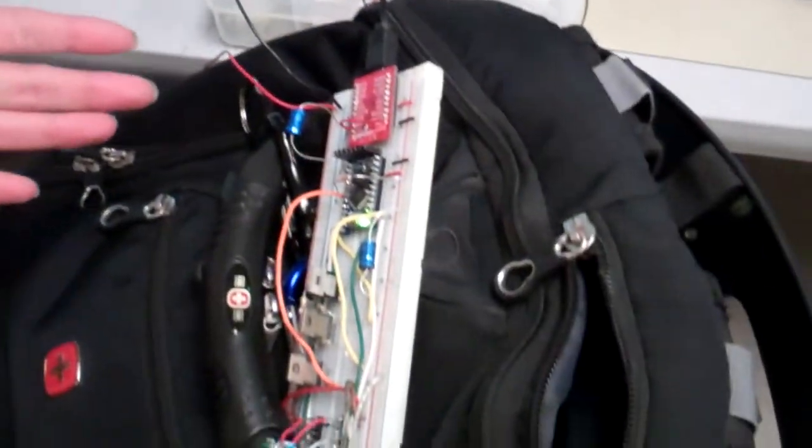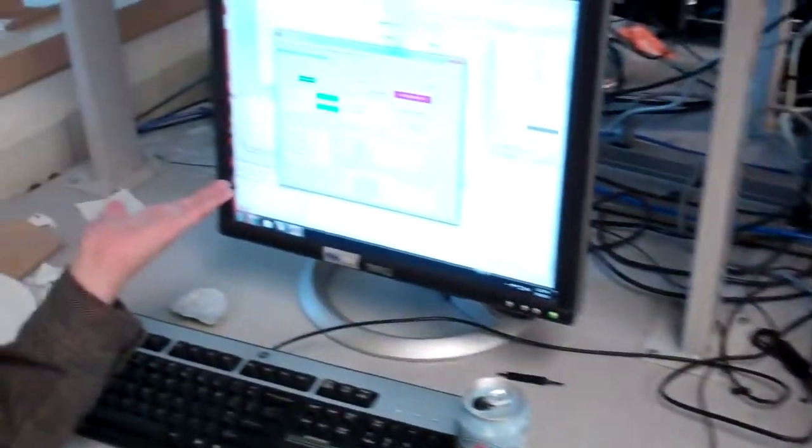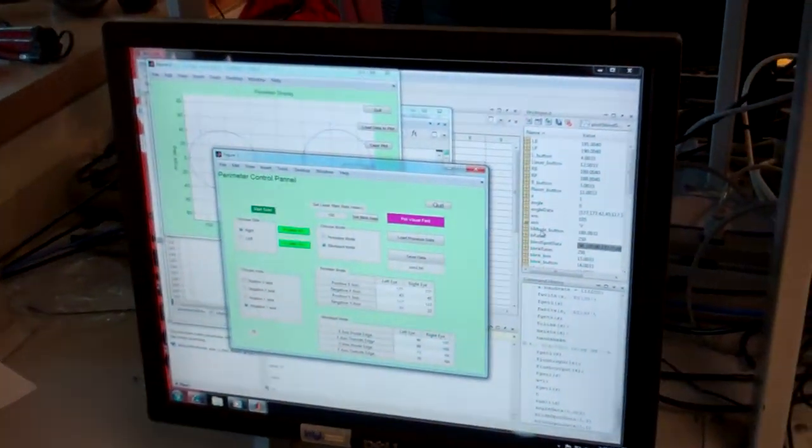The servos are controlled via an Arduino microcontroller, which is in turn controlled by a GUI through MATLAB via the serial connection.